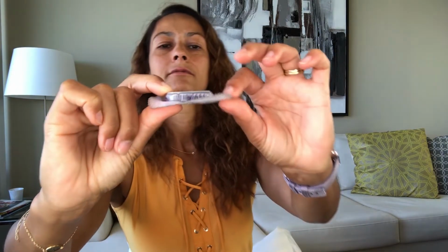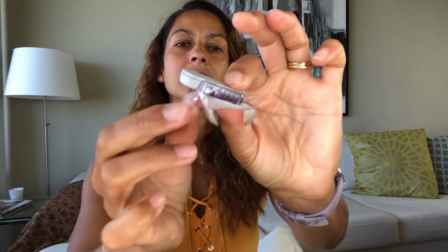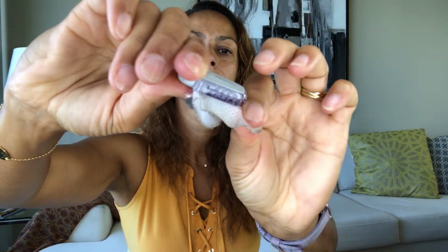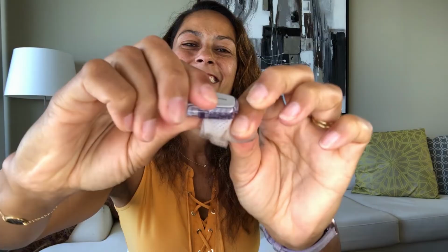Here we go. You ready? So there's a little piece of plastic out here. You hold on to that. Hold on to the sensor. You just break down the plastic like that. It's a little sticky because of the glue remover. Okay, so now the gray part is exposed. See if I can get a hold of that. Sticky. Here we go. Got it out. There you go. That's your transmitter. Just wash that and reuse it.